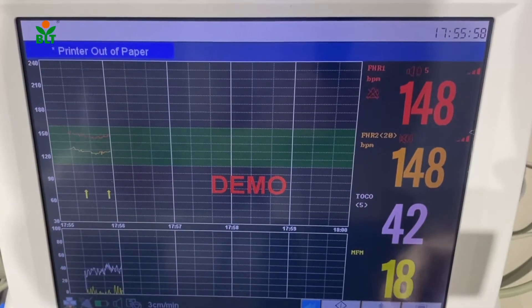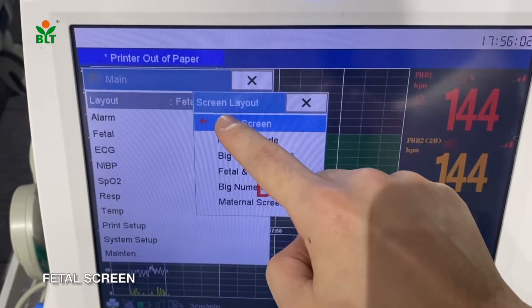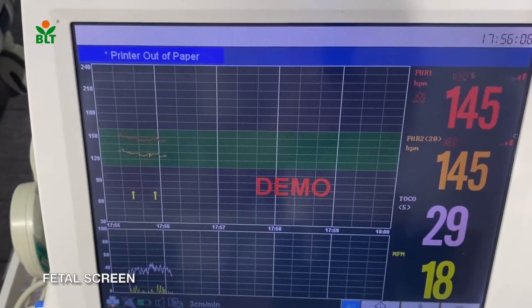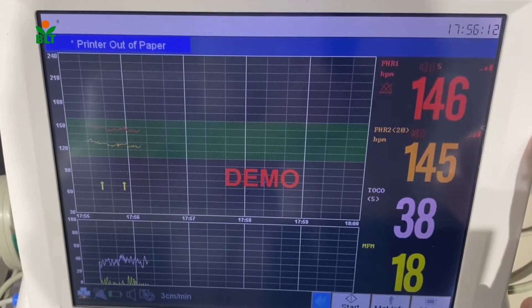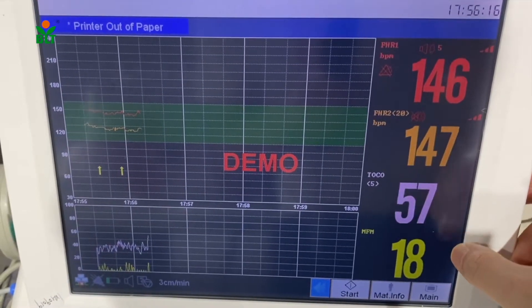When we go to the main menu, we will be able to choose different screen layouts. We have the fetal screen, where we can select fetal heart rate 1 and fetal heart rate 2 to be displayed at the same time. We also have uterine contraction and fetal movement.